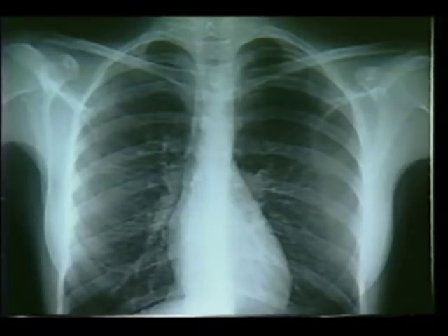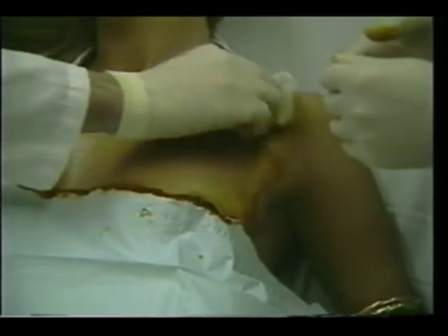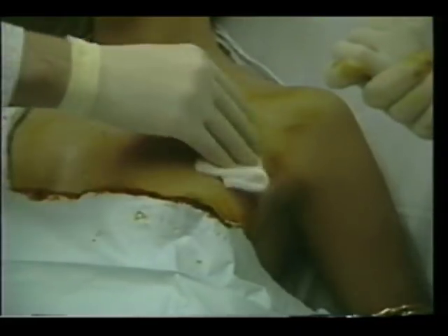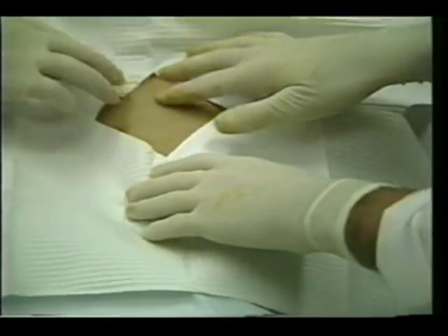This radiograph shows a moderate pneumothorax in the left pleural cavity. Here is the suggested procedure for using the thoracic vent. A site is selected, preferably at the second interspace in the mid-clavicular line. The site is prepared with iodophore PVP, and the fenestrated drape is utilized to isolate the operative field.